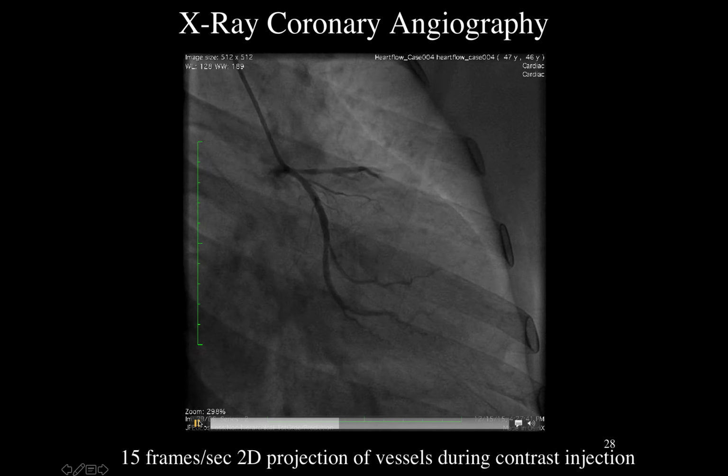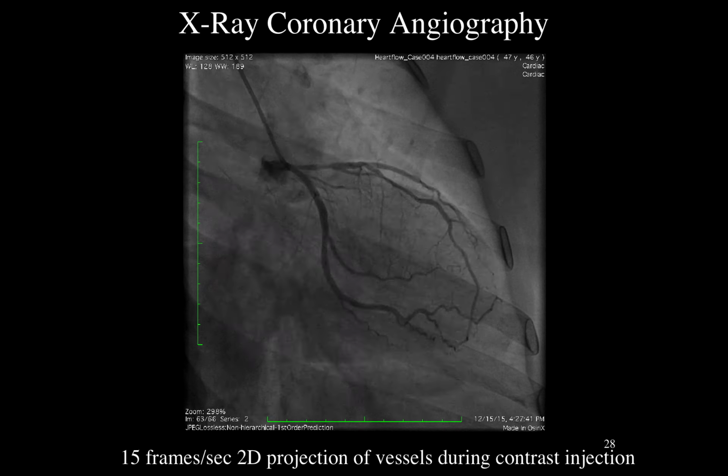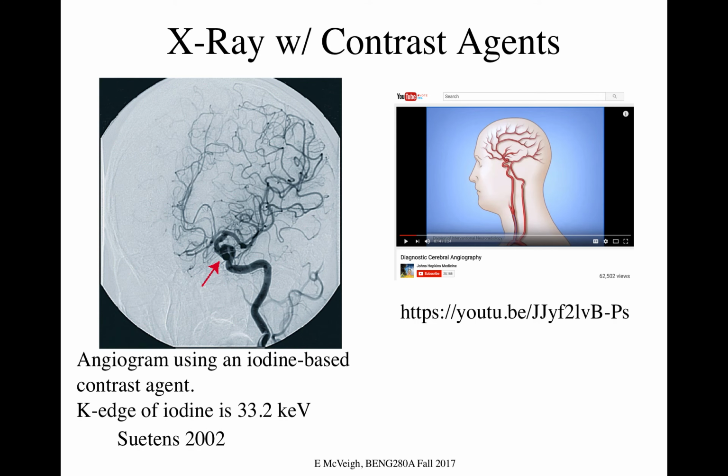And as we saw last time, this is Omnipaque, which is another iodine-based contrast agent to improve the contrast of vessels. We saw that last lecture. And it's also done in neuro imaging, and this actually is in a fluoroscopy system where the patient is lying on a table. You can be doing some kind of intervention, and oftentimes say they have an aneurysm in one of the vessels in their brain that you have to go in and either clip off or put a coil in or do something like that. Then you can inject a contrast agent and watch it go up into the brain and image with super high resolution on an X-ray fluoroscopy system while you're doing that intervention. And that looks like that thing.